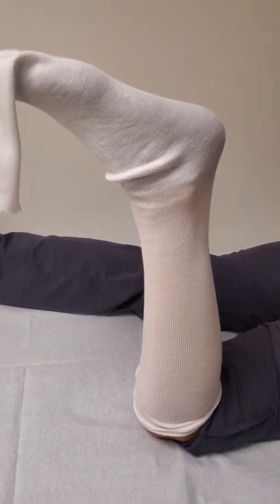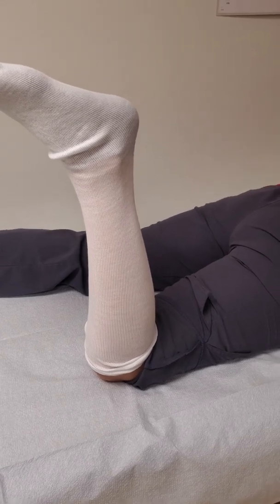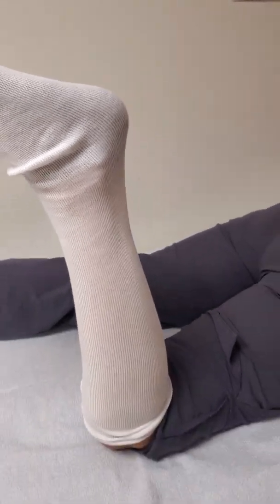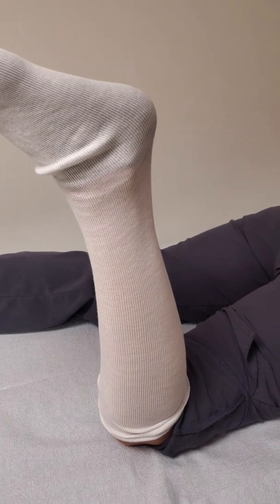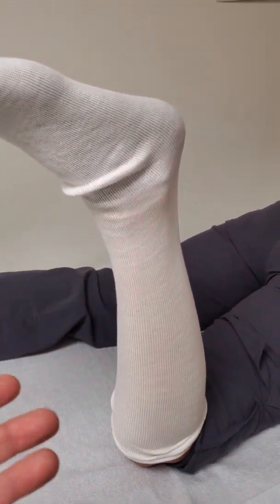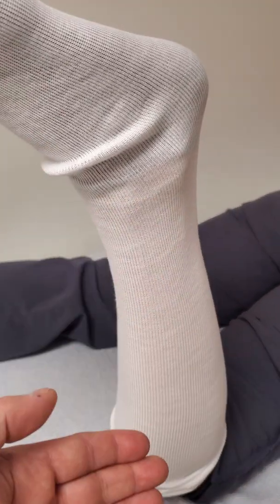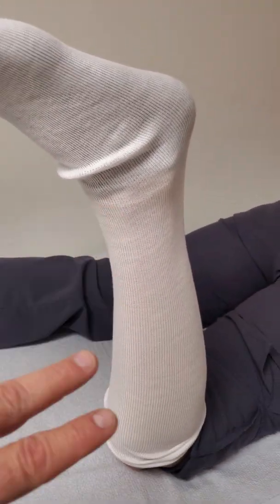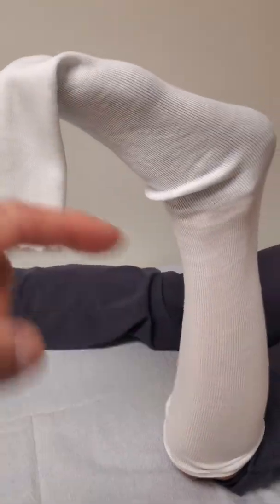Usually some of the urgent cares, ERs, and standalone clinics will not do a stockinette with their splints, and that's totally acceptable. We have stockinette here so we're going to use it. I tend to lean towards using it — it's more comfort for the patient, it's not as itchy with the cotton for a few days. When you use the stockinette, there are a couple of tricks you can do when you're splinting, and I'll show you those as we go along.